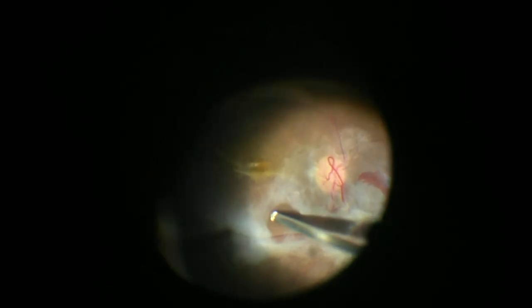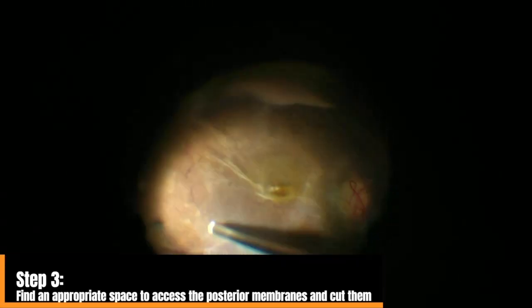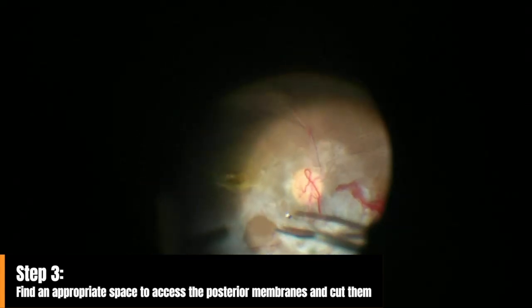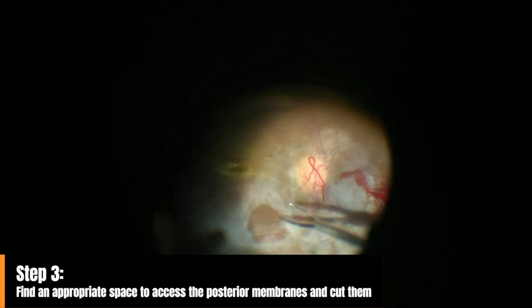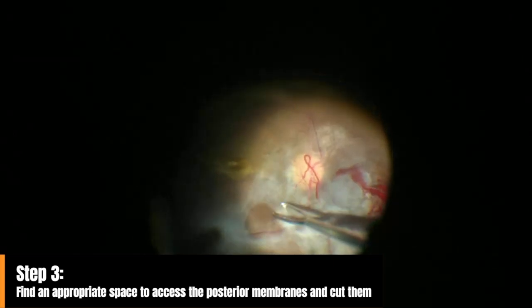Now let's magnify the image to start the real work. It's time to find a good place to begin the dissection of these membranes. Here, as you can see, there seems to be a window where you could start, but it's blocked by the thickened hyaloid. So a good tip is to grasp the edges of the area where you plan to start and use the light pipe to create a small hole. This way, you have a window to access with the vitrector, and then you can proceed to the cut of the membranes, which will be the next step.